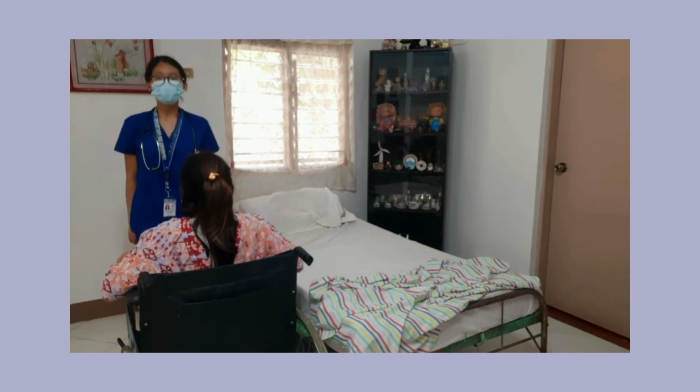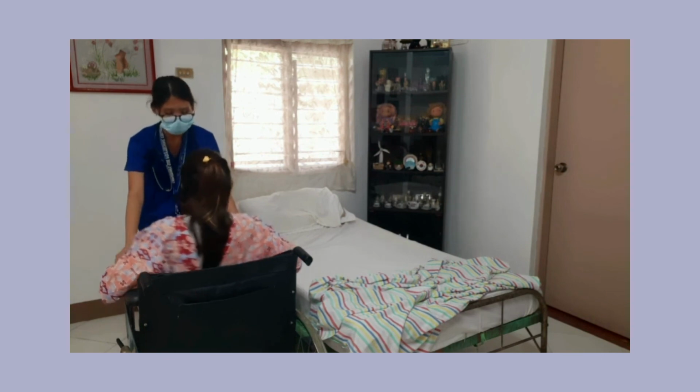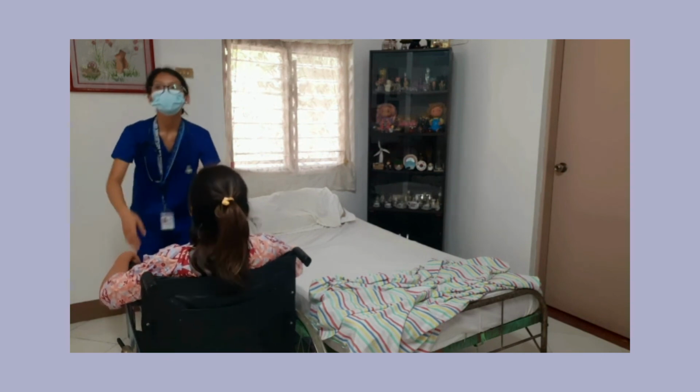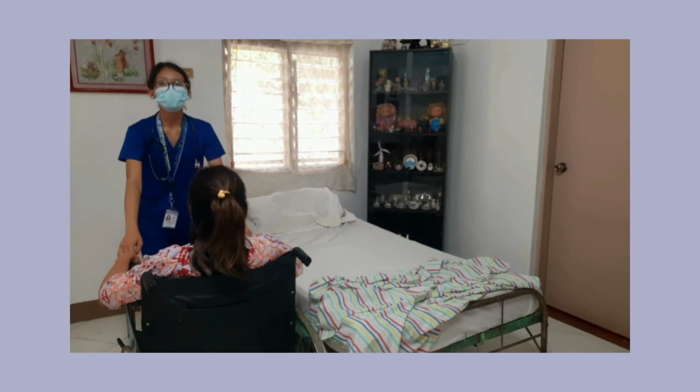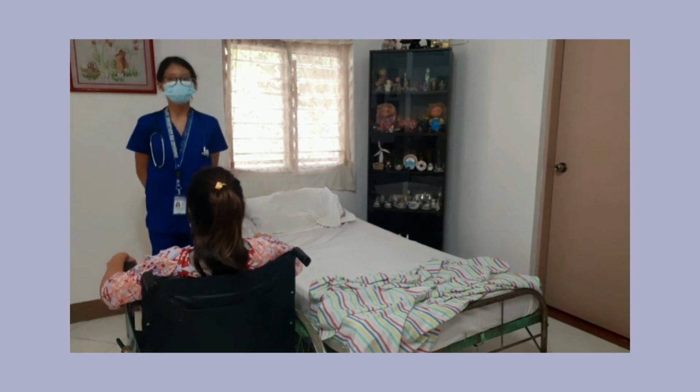Number 10, ensure the client's safety. Ma'am, can you please push yourself back on the wheelchair? And lastly, lower the footplate and place the client's feet on them. Thank you.